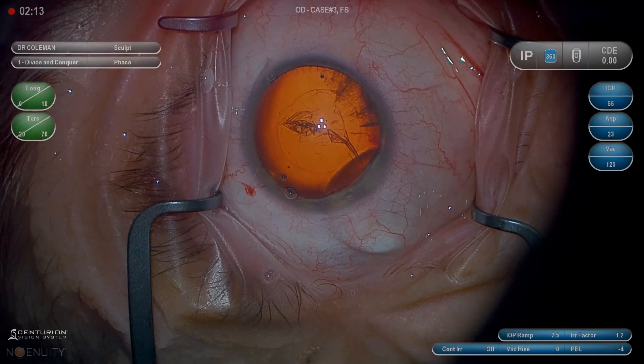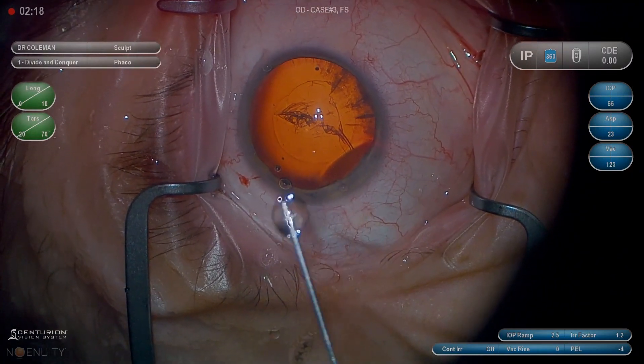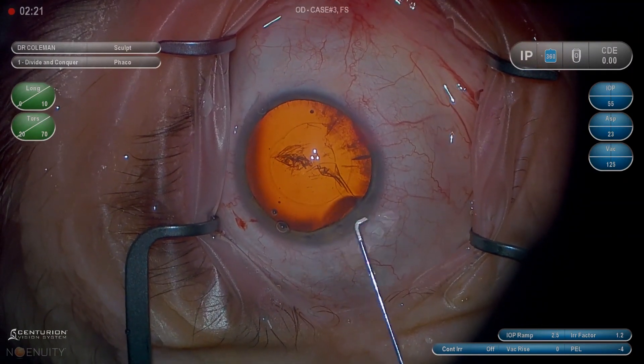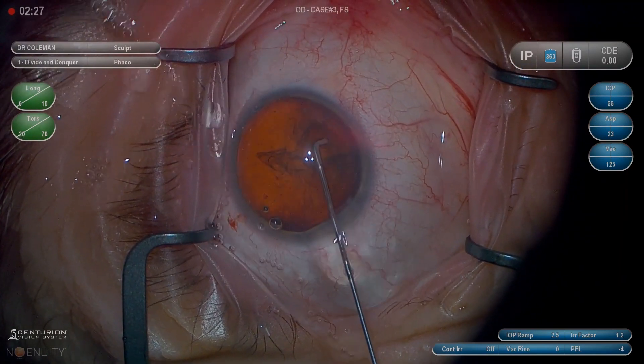This is Dr. Weich Coleman and this is video 3 of 6 in the basic cataract series. This segment is just on hydrodissection. This is 10 random cases with hydrodissection — 3 minutes and 50 seconds of actual case time, so about 35 seconds per hydrodissection.